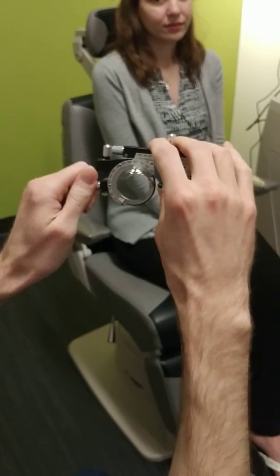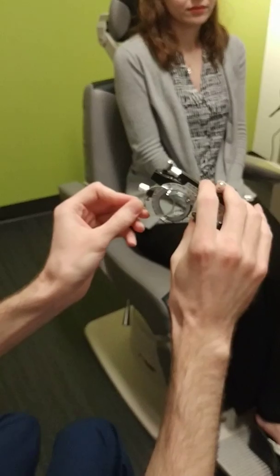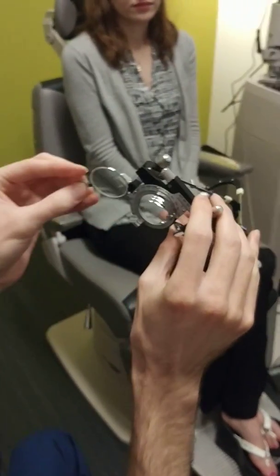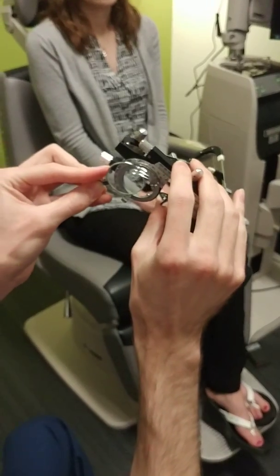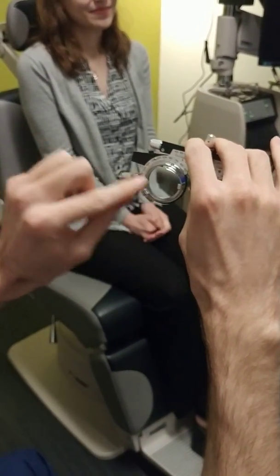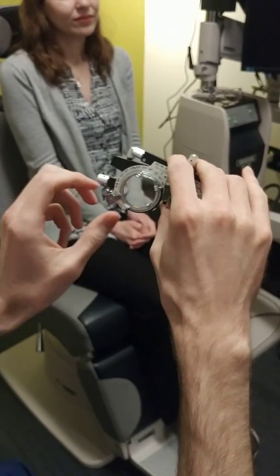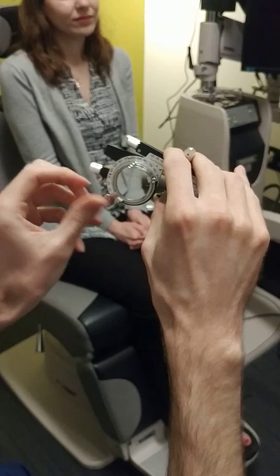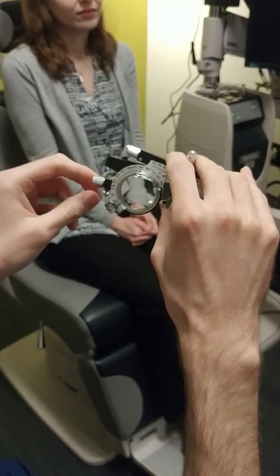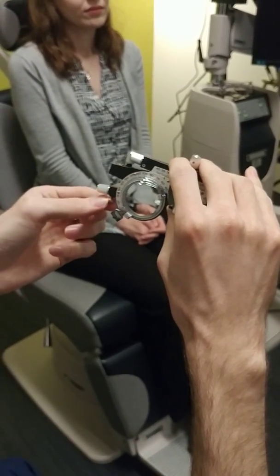You can spin this around to change the axis of your lens. If I put a cylinder lens in, you can see how this works. The cylinder lenses all have axis marks, so you can spin this around to have it at the correct axis. I like to have them all the way up against the edge so they won't spin around. But if your trial frame is kind of old, you might want to lock your axis here by spinning it in — by tightening it.